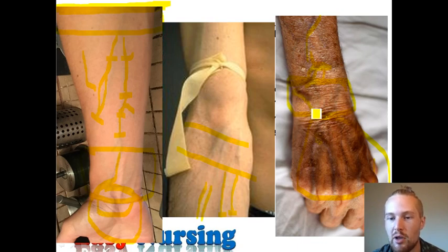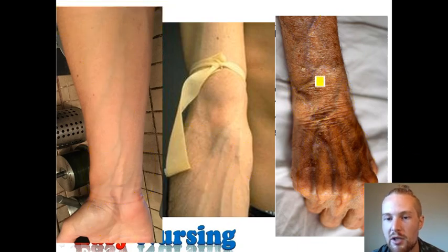This is nice and plump, but like I said, by the time the tubing comes down, it may be in the way. So let me go ahead and clear this. I'll show you where I would start the IV on this patient. Probably start it here, and it would probably run up to about here. That would probably be the best shot for this patient.